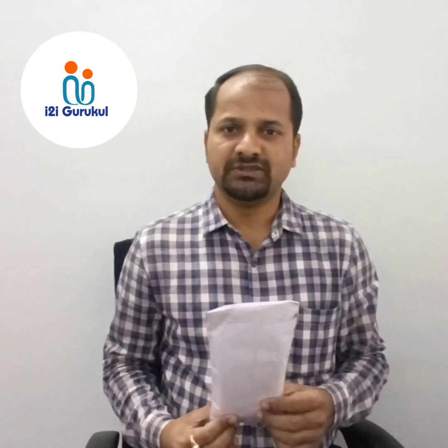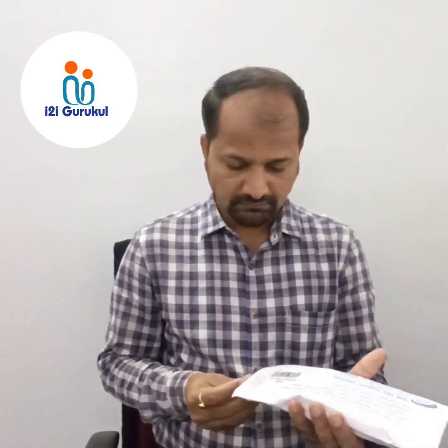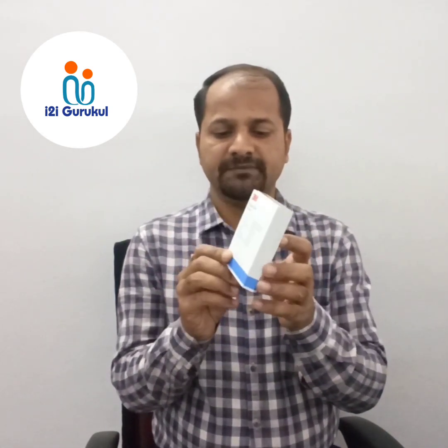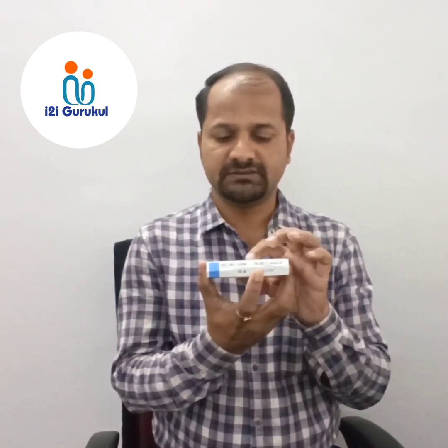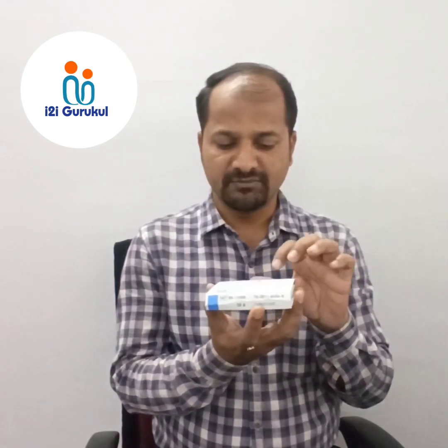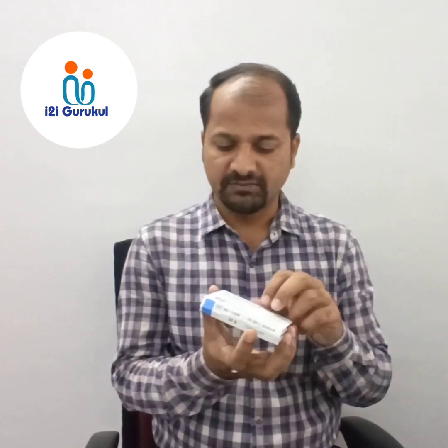Before starting my session, I would like to show how to unbox the Fresnel prism and what to read on the Fresnel prisms. This is the packing I got from the distributor. This is the 3M Fresnel prism packing, and on the box cover you will see the diopter of the prism, packing date, manufacture date, serial numbers, and manufacturing details. The 3M Fresnel prism label is written in many languages — English, Spanish, and Chinese — because this is a worldwide product.